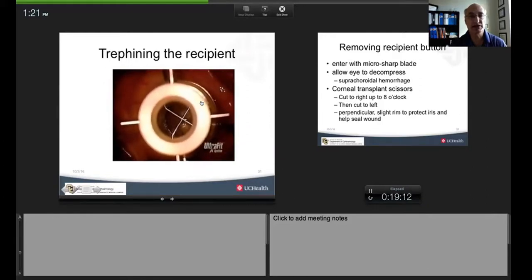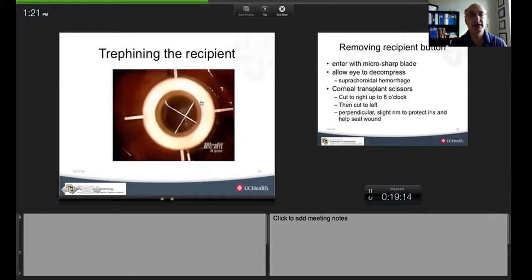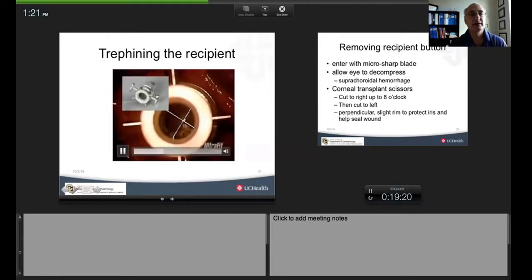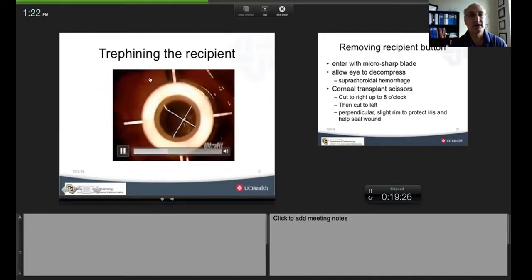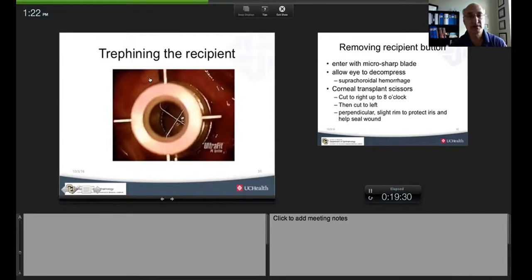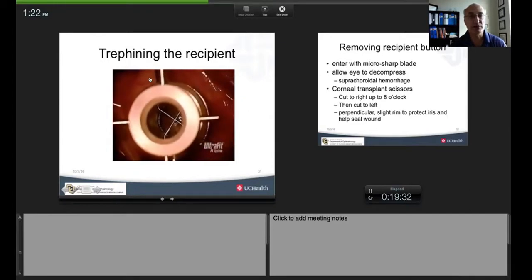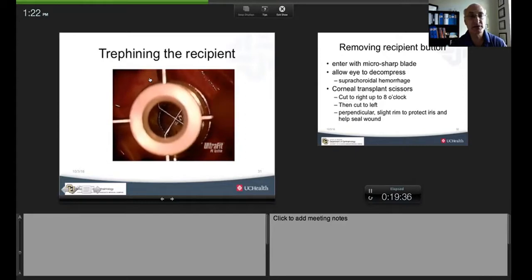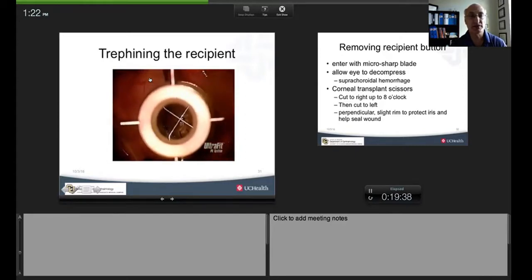Then I engage suction. Notice that we're looking down the barrel, and you can see the dot that I made earlier to ensure that the trephine is centered. So we're going to back off 3/4 turns or even 6/4 turns from the 0 point before we actually trephine, so that as you engage suction, you don't start cutting the trephine before you mean to. Then you advance back to the surface. If you backed off 6/4 turns, you generally advance 6/4 turns.